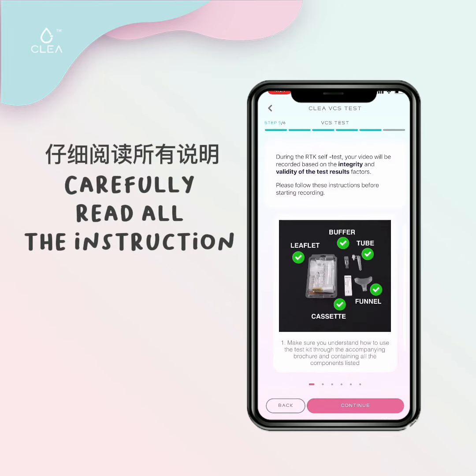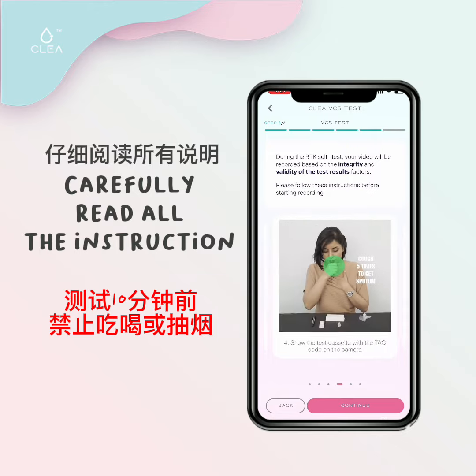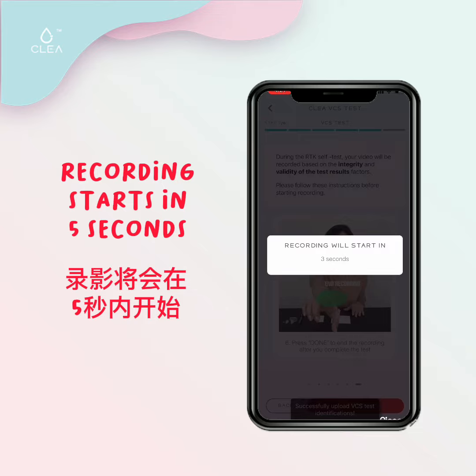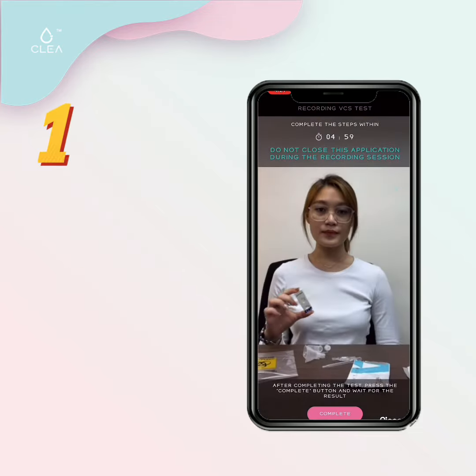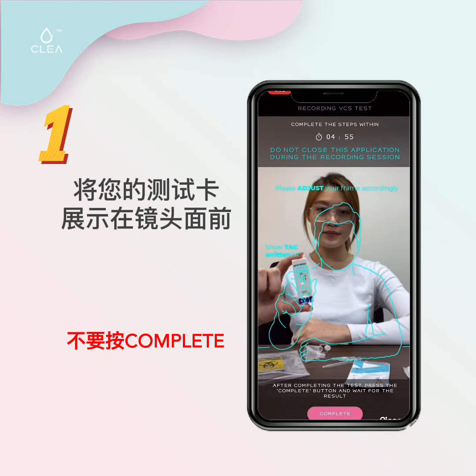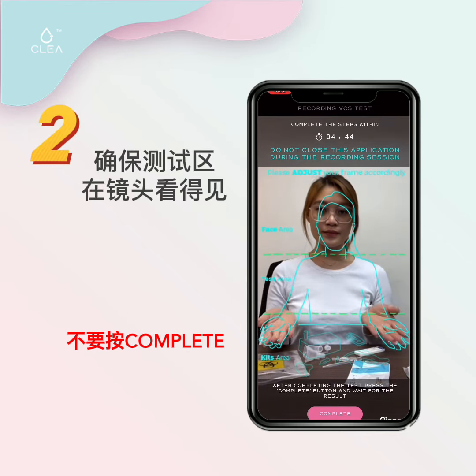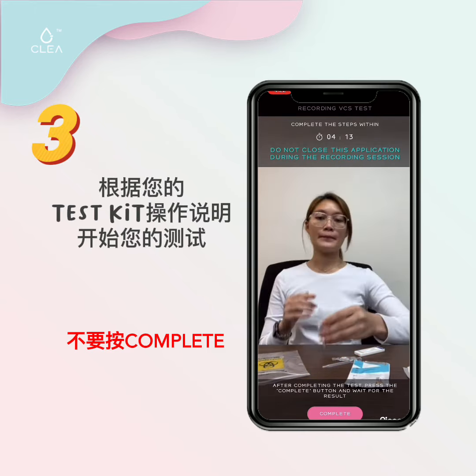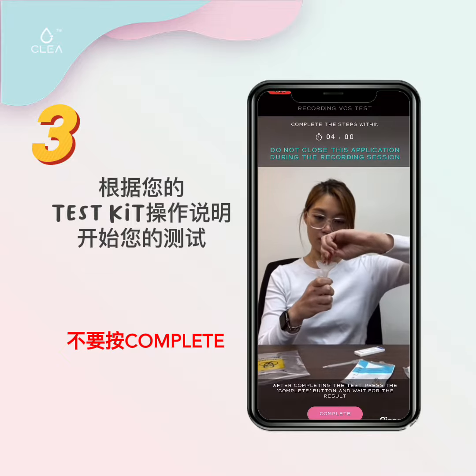Follow this step-by-step guide for your recording. Remember not to eat, drink, or smoke 10 minutes before your test. Show your test kit cassette with the TAC code written on it, and ensure all these things are within the frame. Please proceed with your test procedures according to the instructions that come with your test kit.